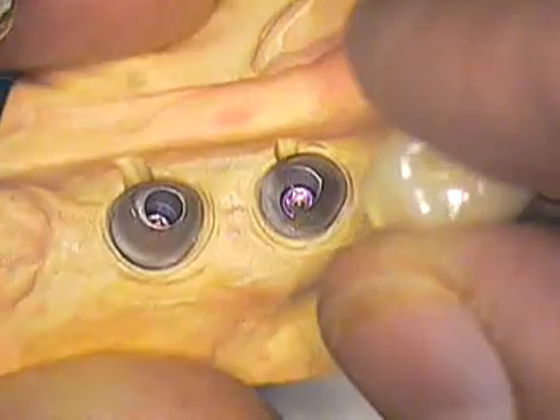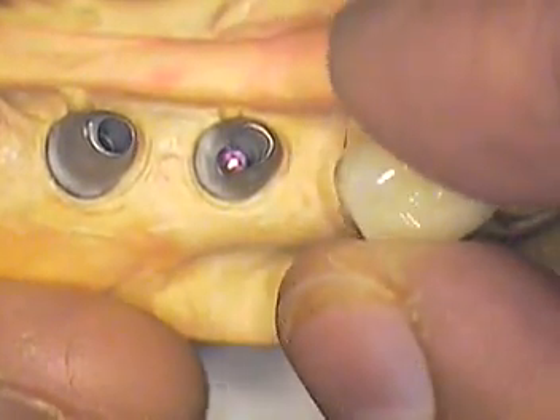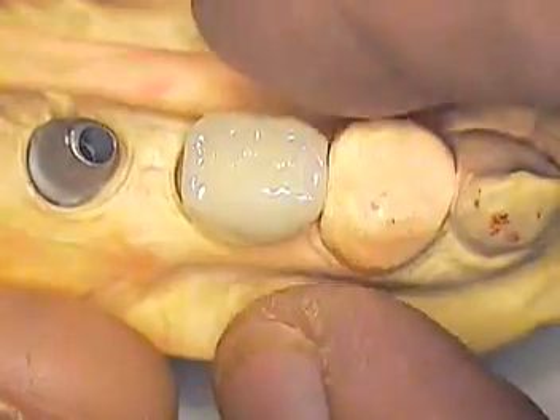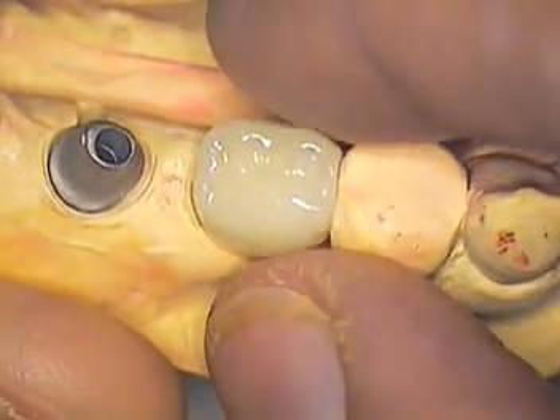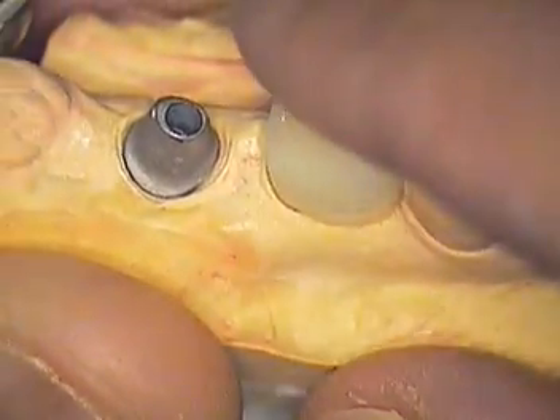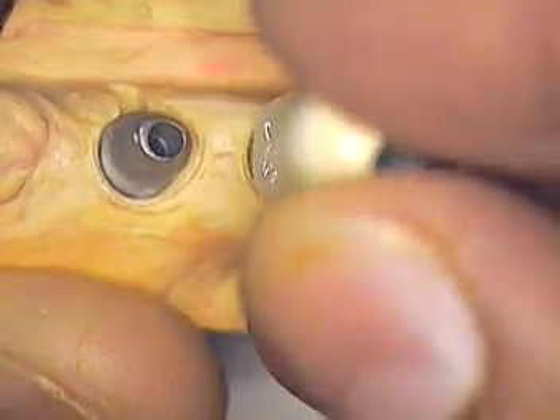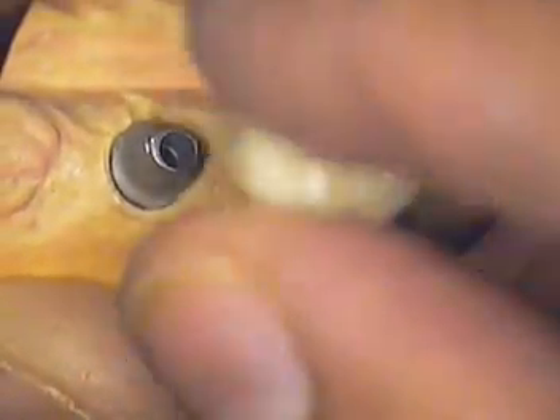We will find out just exactly how retentive this case is going to be come next week when we go to try it in. My biggest fear is that this tooth is going to be somewhat non-retentive in the long term and might have to re-cement it. The other crown definitely shows much more of a better design as far as retention.